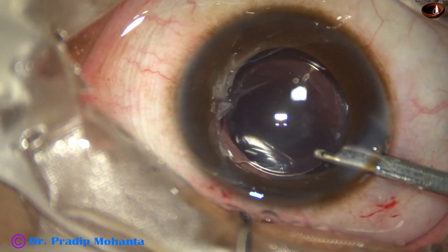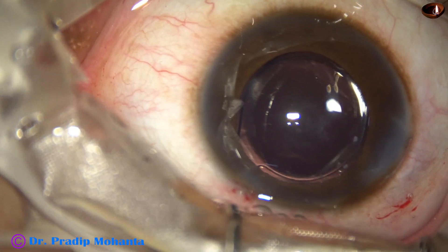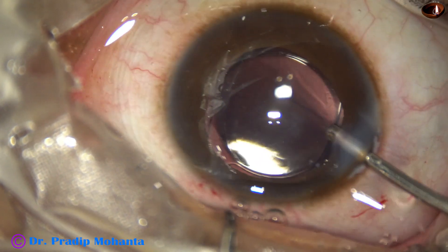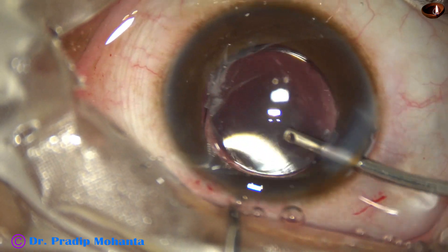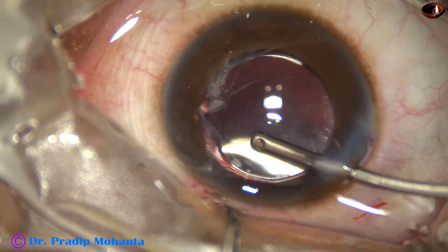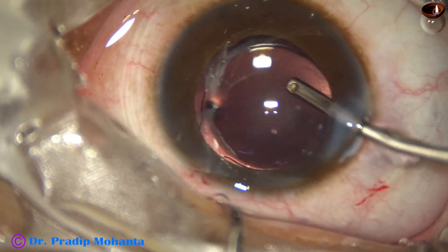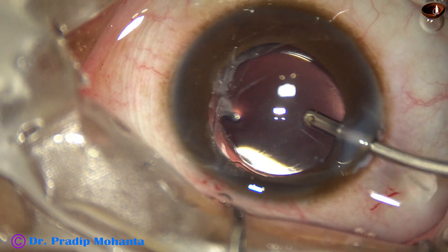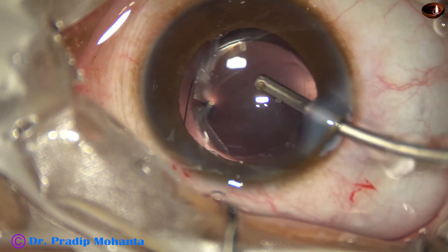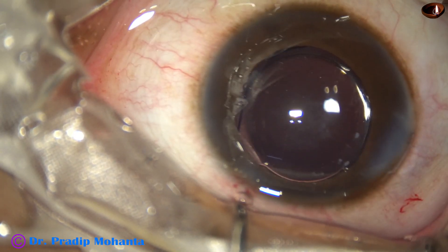And now use the Simcoe again for removing the viscoelastic from the anterior chamber. There is no visco remaining in the capsular bag. This is another thorough wash by the irrigating probe — thorough irrigation all around. Visco cleaning should be thorough to avoid post-operative rise of intraocular pressure. So thorough removal of visco has been done.